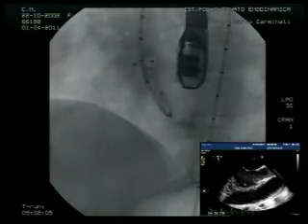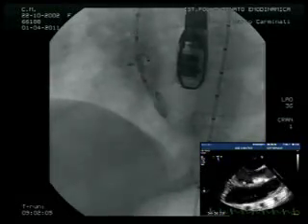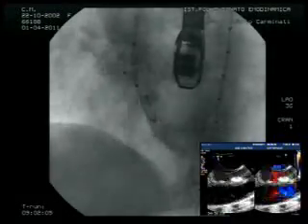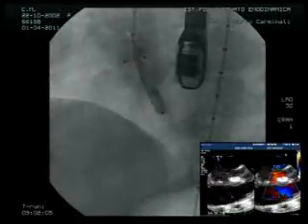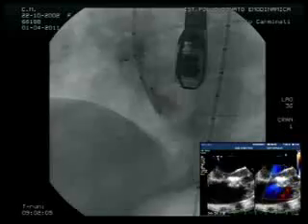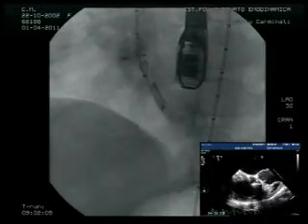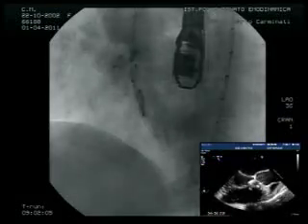Well, there is a lot of flow across the device as expected when we release and do an angiogram immediately afterwards. But I think the echo pictures are more informative at this point. Kevin, what do you think? I think it was a mistake to do an angio. Now we're worried. Well, we've been asked for. I think we'll do an aortogram anyway.